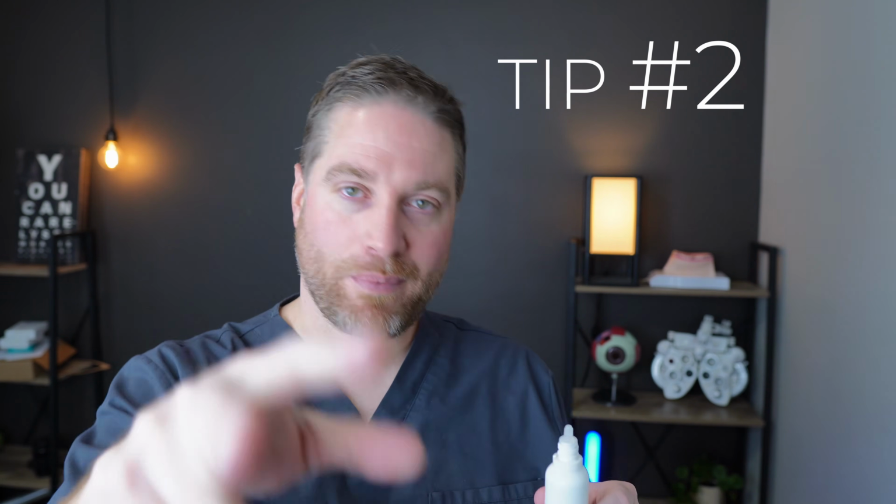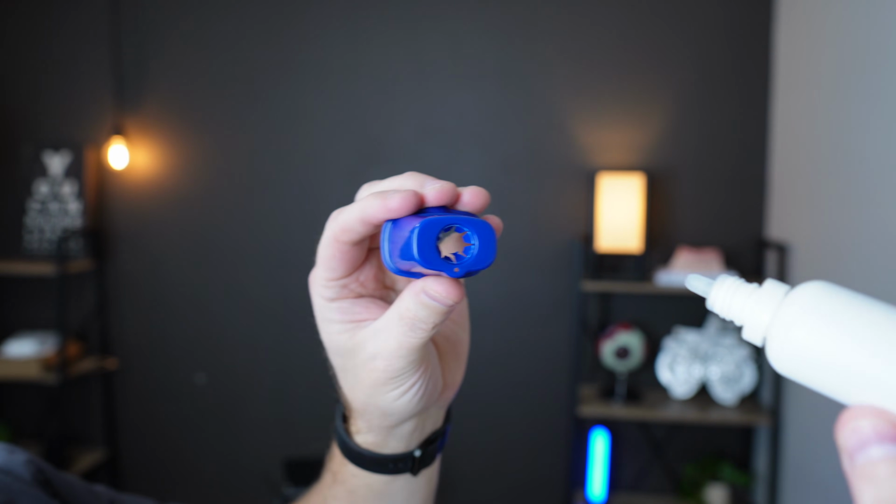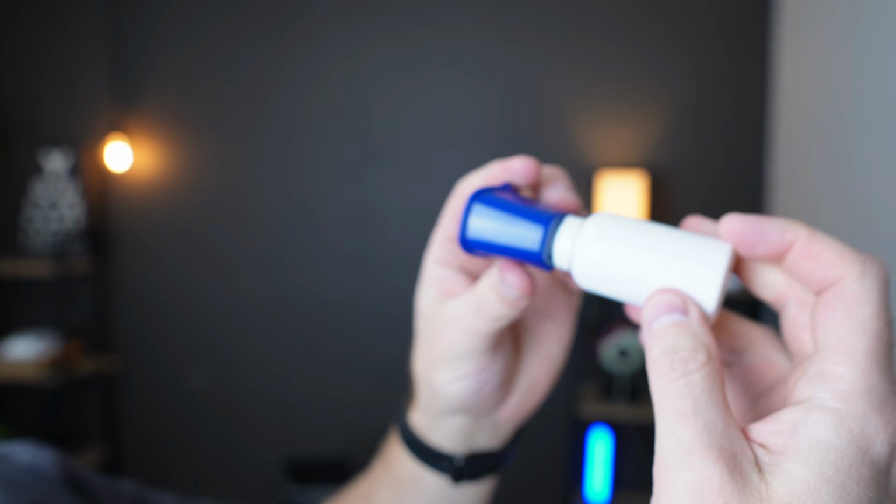Now, if you tend to miss the eye drop a lot, you keep it in your cheek, or if it runs off the side, then tip number 2 is going to help you out. Now, you can actually find a lot of eye drop helper tools on Amazon, Walmart. There are a bunch of different kinds. Kind of like this one I got off Amazon. It's not very expensive, but you can actually put it on your eye drop bottle, and then this will go right over your eye socket.